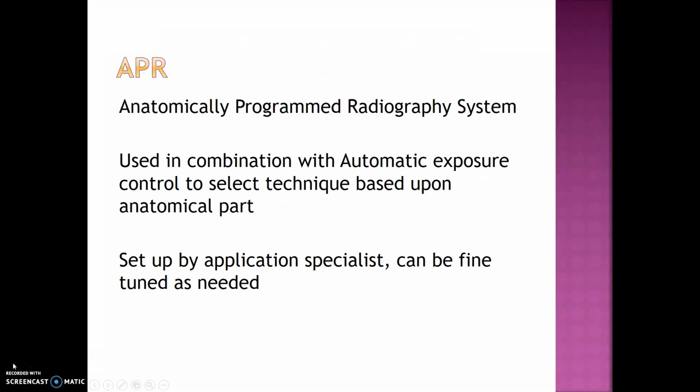Anatomically programmed radiography systems, also known as APR, are used in combination with automatic exposure control to select techniques based upon anatomical parts. This is set up by an application specialist and can be fine-tuned as needed.